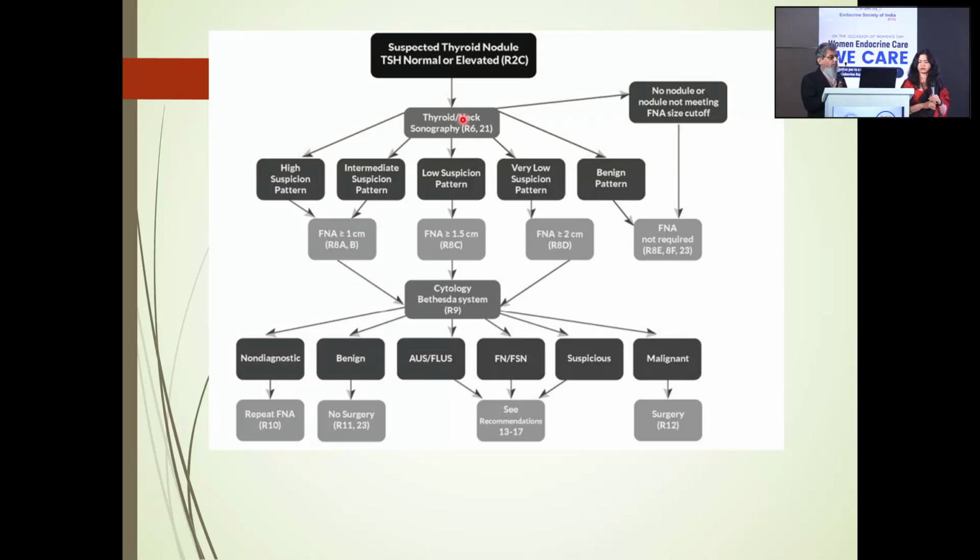And secondly, the pathologist gives a non-diagnostic aspirate, which makes the patient feel very nervous that the doctor didn't do the job well. Both of them say non-diagnostic means you haven't done the job well. So you have to simply tell them that the nodule belongs to that category. If it is non-diagnostic and TIRADS 1 also, we would allow it to pass as normal, and there would not be any further imaging or further FNAC required. But for something in the Bethesda 3 category, there we would sometimes do a repeat FNAC to make it a little bit more concrete.